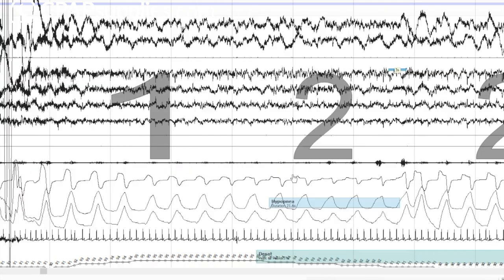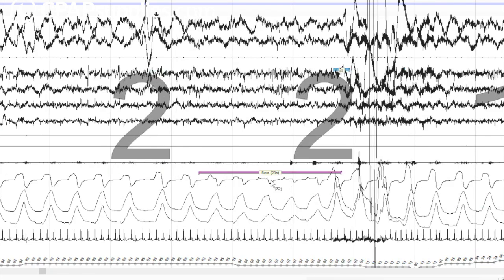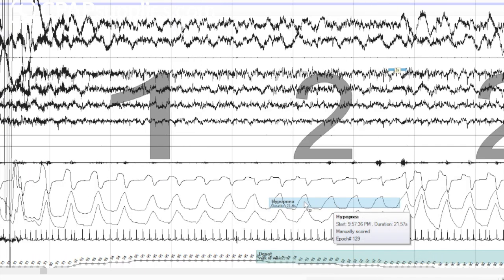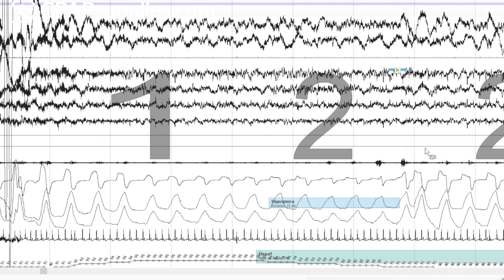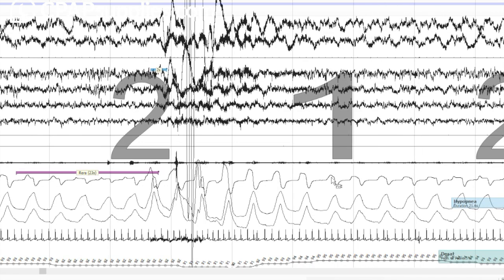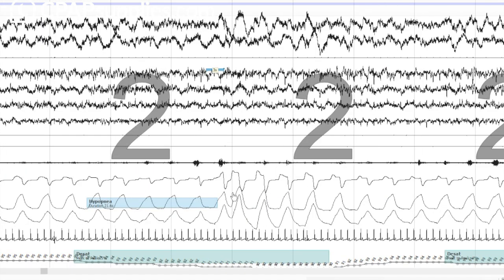But as we move on, what's the difference between this one and this one? This one's now a hypopnea. Actually, the arousal lasts for less time, which really doesn't matter. They woke up. But now we have a blood oxygen desaturation of 5%. So now it's magically a hypopnea, even though it's just as disruptive. Yeah, I don't know. Make that make sense.